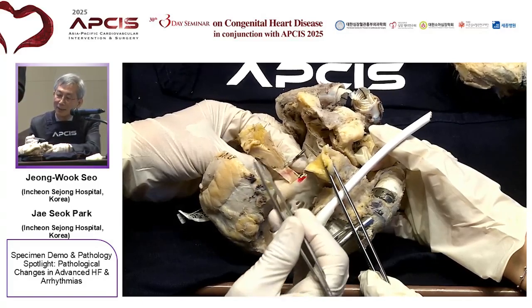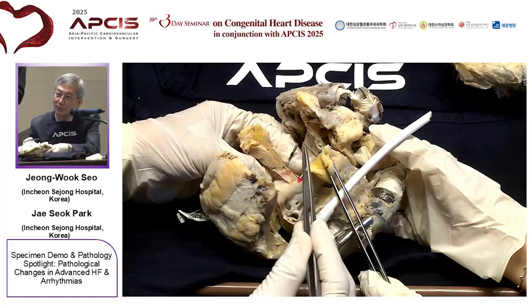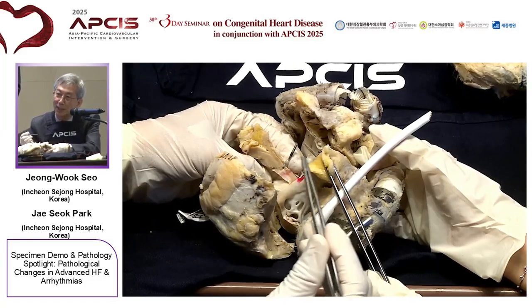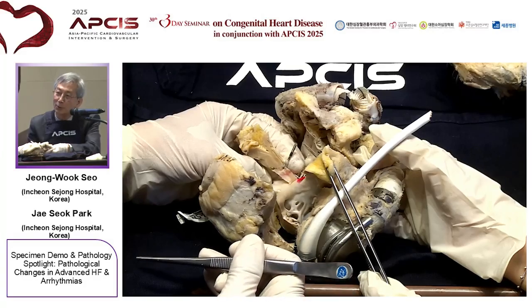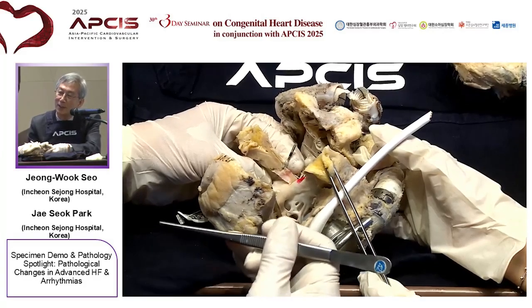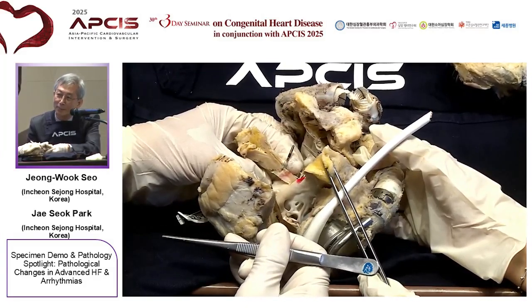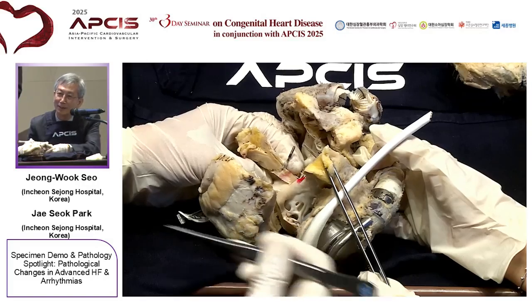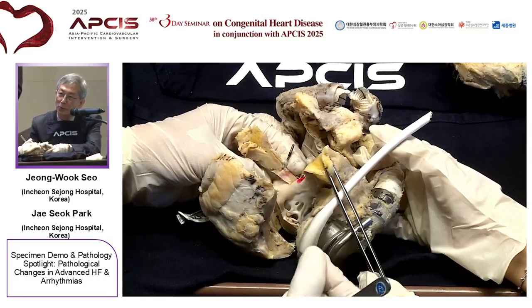And then for the third, the CSP lead, he tried to place it through the subclavian vein, but it was very hard to approach due to fibrosis at that area. So it was not complete for his design. So the rotation torque was not enough.